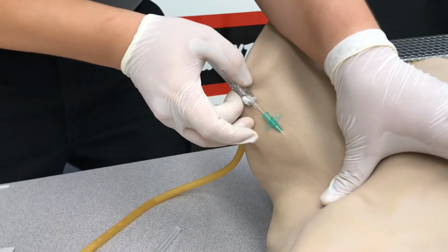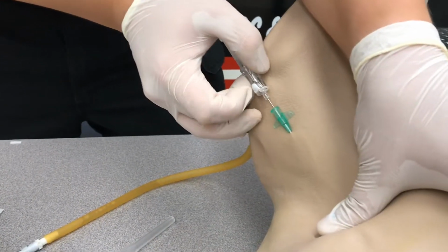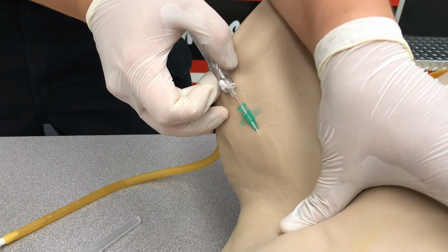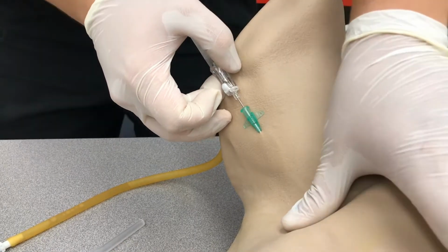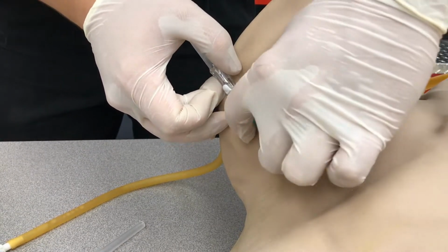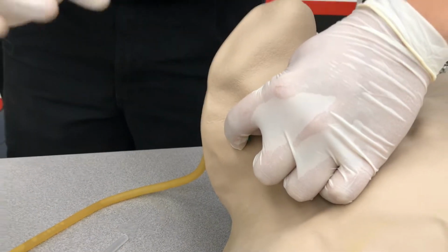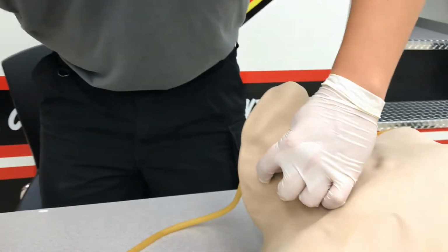And now at this point, you need to move your hand so that you're tamponading before you hit that button. If I hit the button right now, it's going to start bleeding, and you might also get the air embolus. So I'm going to shift my hands, tamponading and stabilizing, and now I'm just going to simply push the button. It retracts the needle, and we'll put that in the sharps.